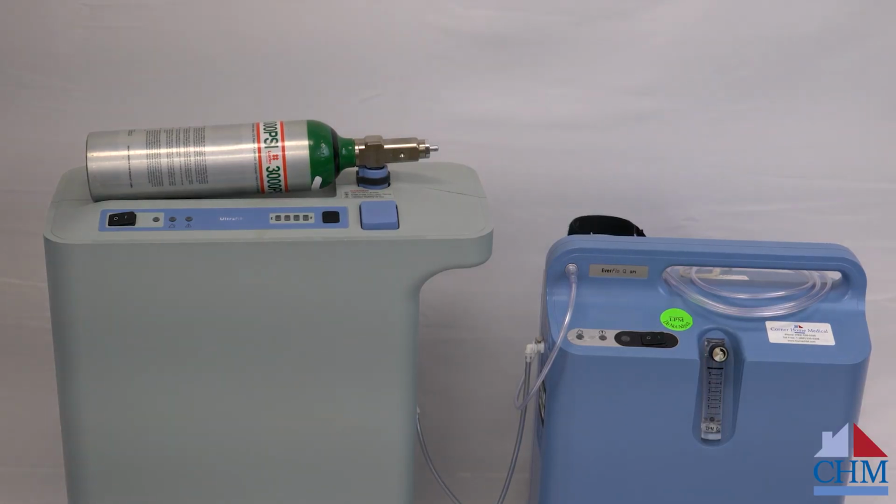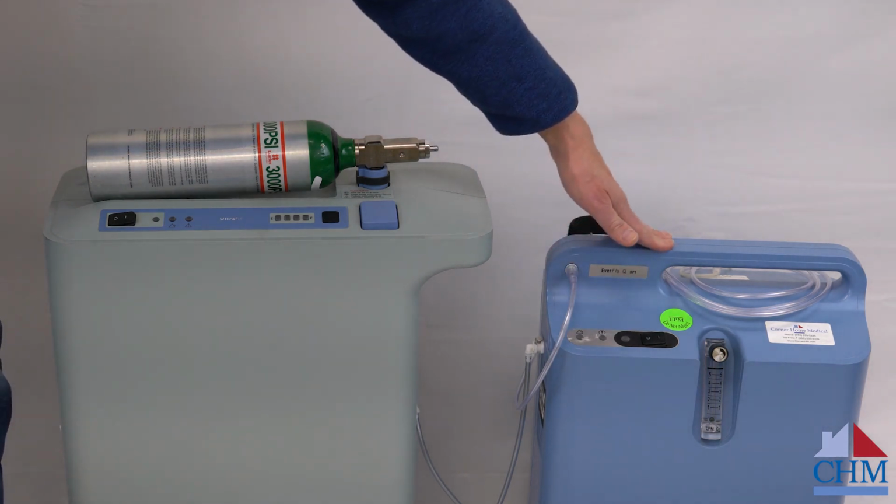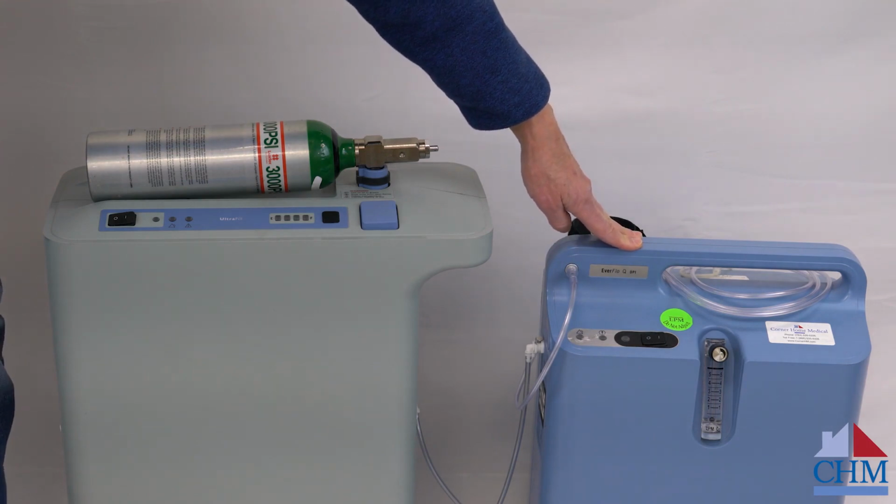Here we're looking at the Respironics Ultrafill tank filling system. And you'll notice that the system is made up of two parts. There's two components to it. This is the oxygen concentrator, and the oxygen concentrator is the oxygen source.